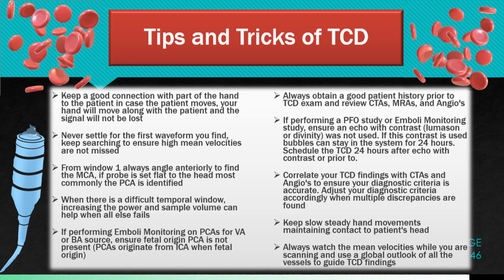Always obtain a good patient history prior to TCD exam and review the CTAs, MRAs, and angios. It's always good to have a good knowledge of what is going on with each of your patients before you walk in the door. If performing a PFO study or emboli monitoring study, ensure an echo with contrast, Lumason or Definity, was not used. If this contrast is used, bubbles can stay in the system for 24 hours. So you'll want to schedule your TCD 24 hours after echo with contrast or do your TCD before echo.